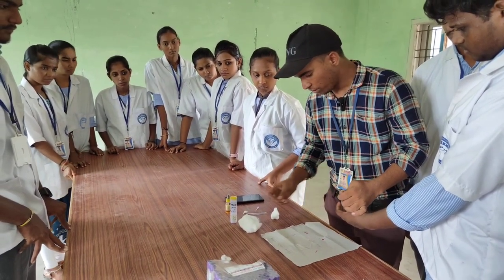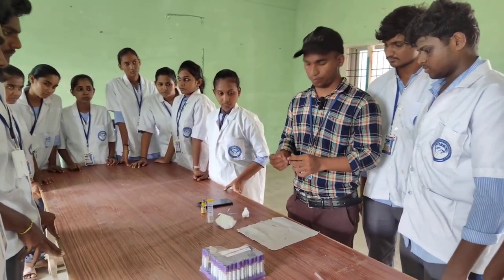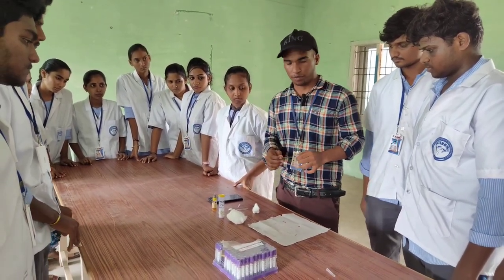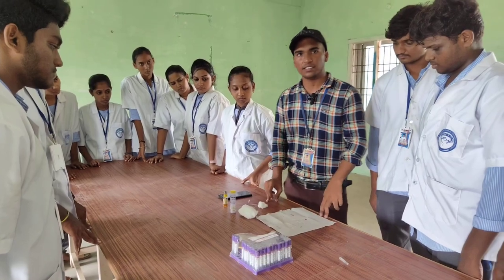Next process: take the capillary tube and rotate it. Blood is rotated inside. After rotating, the stopwatch starts from 0 seconds up to 180 seconds.